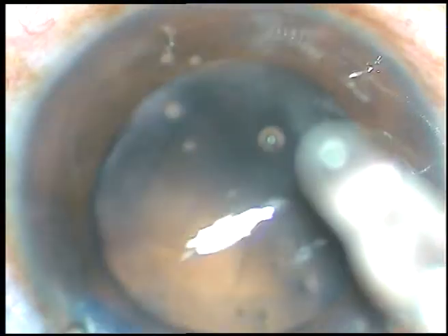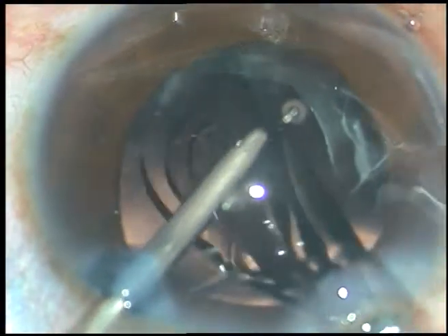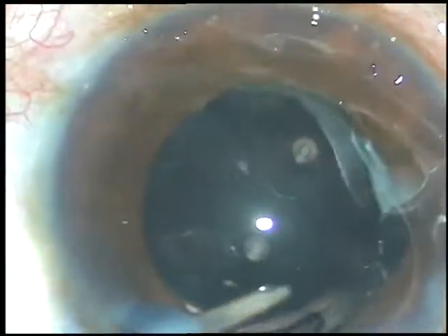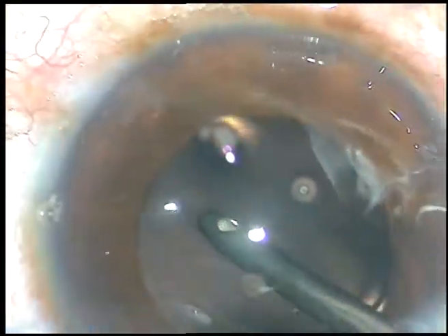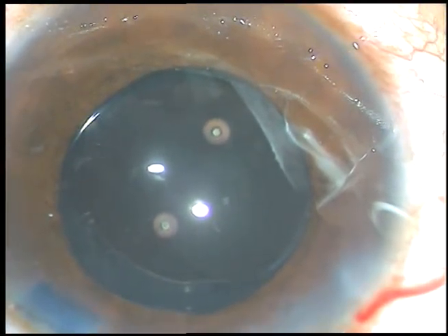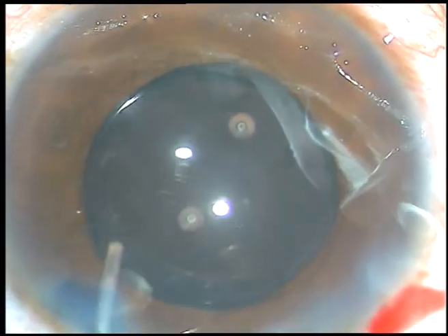Now a foldable intraocular lens is being implanted. The anterior chamber is kept formed by irrigation, and the irrigating probe places the lens in the capsular bag. Since the intraocular lens has been implanted keeping the AC formed by irrigating fluid, there is no viscoelastic substance to be cleaned.